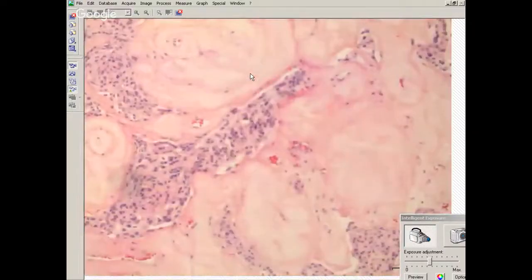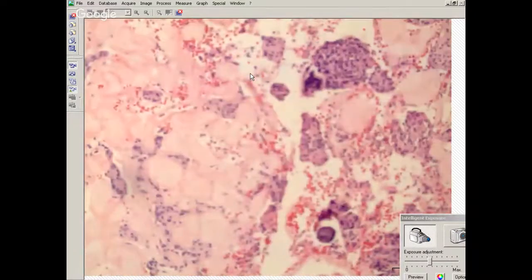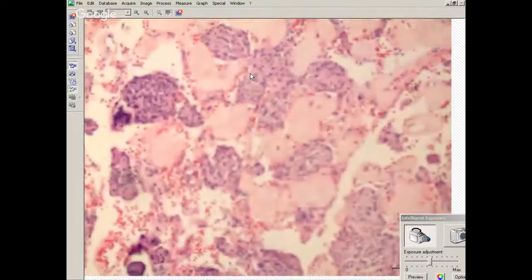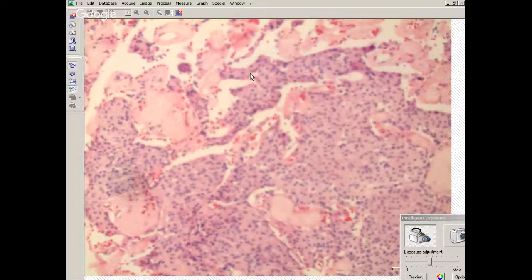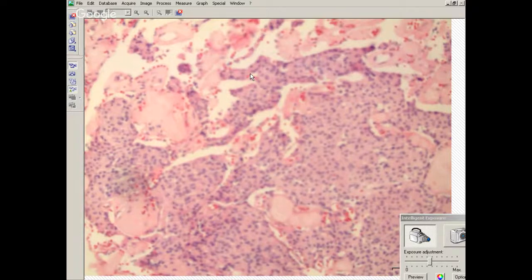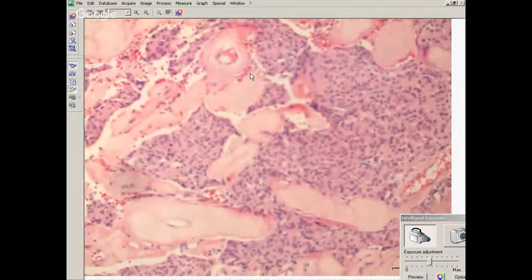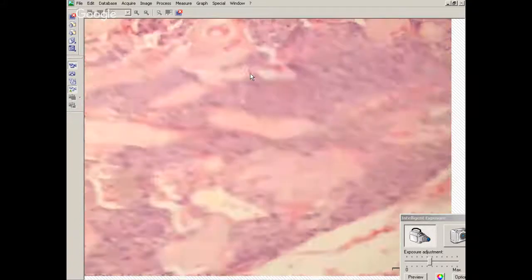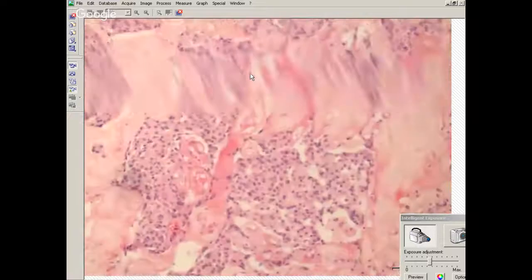Meningioma. Any meningioma that's a low-grade meningioma, you can call it a meningioma straight up and not subclassify it as anything. Part of the reason why you want to subclassify some meningiomas, depending on the histologic type, is that some histologic types of meningioma are by definition grade 2 or grade 3. Many of the low-grade meningiomas are subclassified because they can be confused with other things. So in this case, we have thick hyalinized blood vessels, and that's indicative of an angiomatous meningioma.